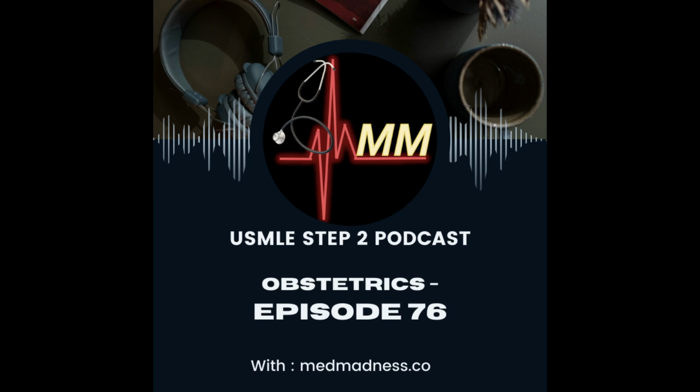In contrast, the T sign is associated with monochorionic pregnancies, where the intertwin membrane forms a T-shaped junction with the placenta, indicating a single shared placenta. The presence of the twin peak sign and the absence of the T sign help in distinguishing DCDA twins from MCDA twins, which share a placenta.